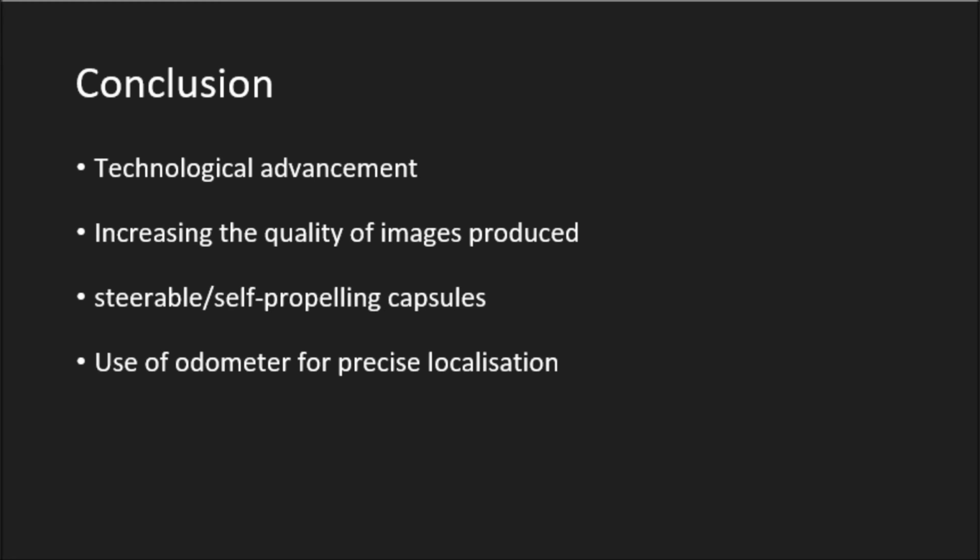The capsule endoscope is the better alternative to the conventional endoscope, as it has the potential to become even more advanced in the future, with more and more research being conducted to improve its disadvantages.